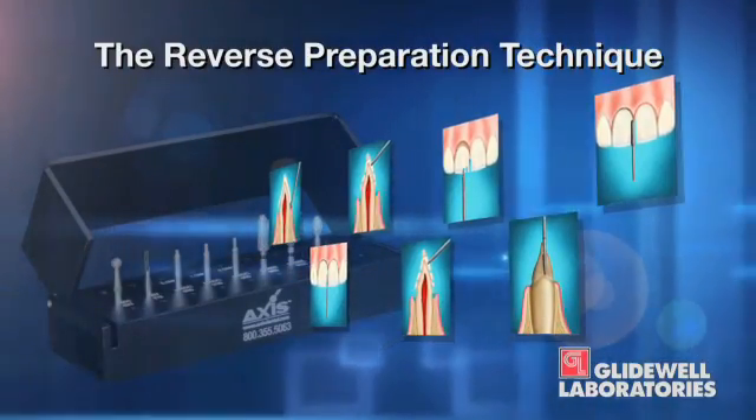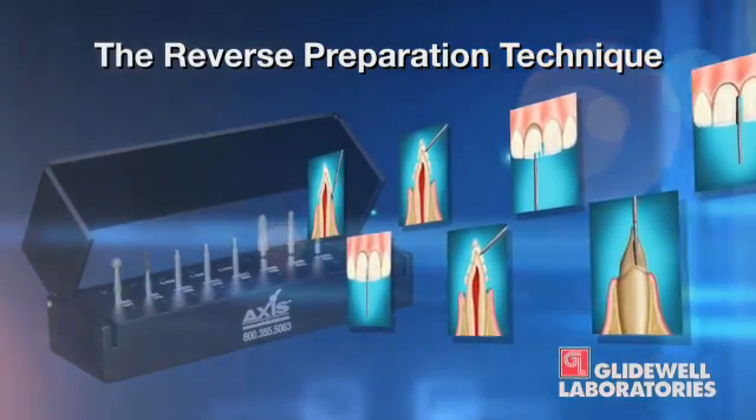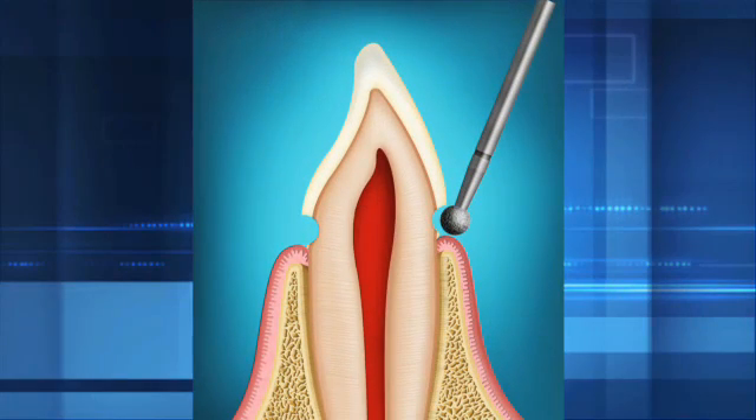It's called the reverse preparation technique because unlike in dental school — where we were taught to prepare the rest of the tooth first and the gingival margin last — this technique starts by prepping the gingival margin first. That makes it much easier to get a nice, uniform, clean margin, which is critical for ensuring the laboratory can give you a restoration that fits very well at the margin. By prepping the gingival margin while the rest of the tooth's hard structures are still intact, it's much more predictable.